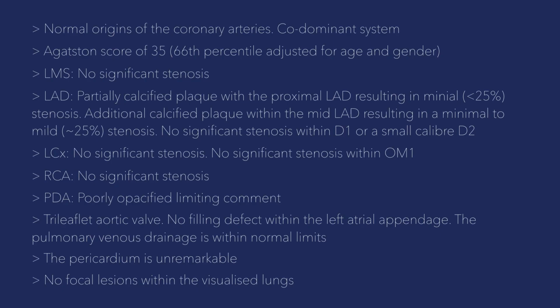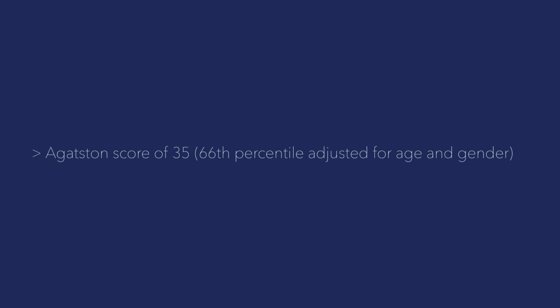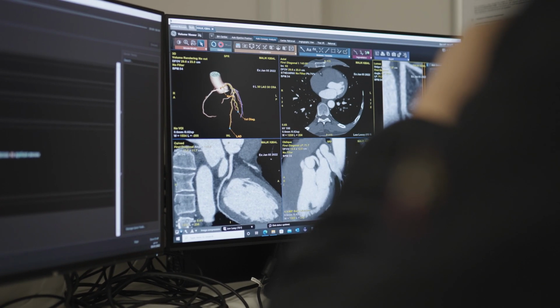As you get older, the calcium score rises, and it's calibrated to your age and your gender. Ladies have less calcium, it occurs later, and obviously the older you get, the larger the calcium. So my calcium score has an absolute number, but also a percentile. And that is not a degree of narrowing of the artery. So I'm at about the 60th percentile, which basically means I'm in the middle of the curve for my age and gender.